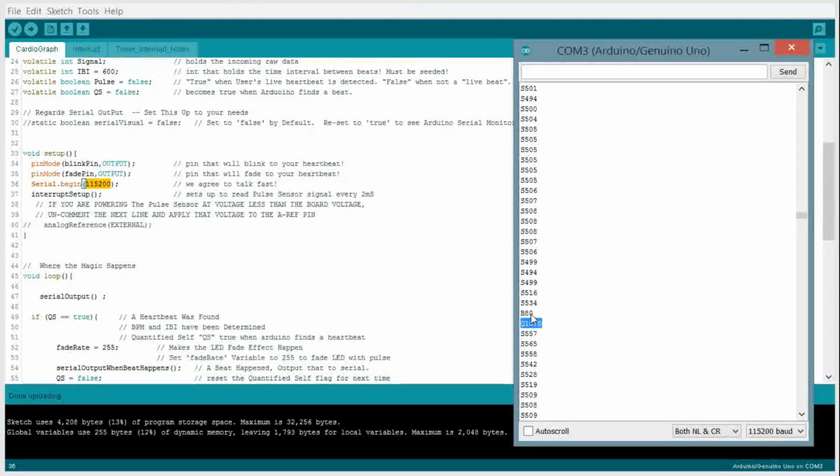Anyways, that should give you a good idea of what this sketch is doing. And if you want to get a head start copying down the code, it's here in the video, but I will post a link to GitHub so that you can download all this.